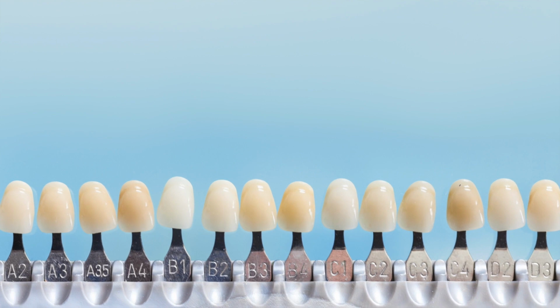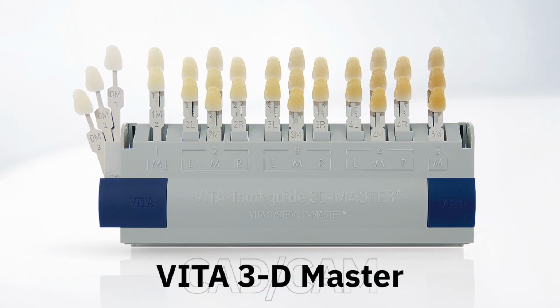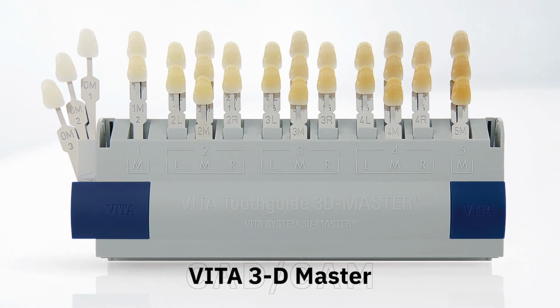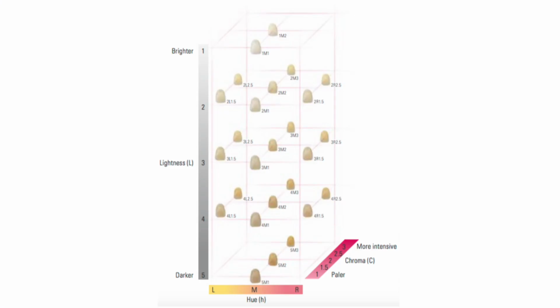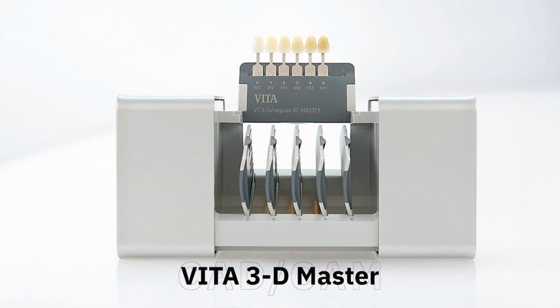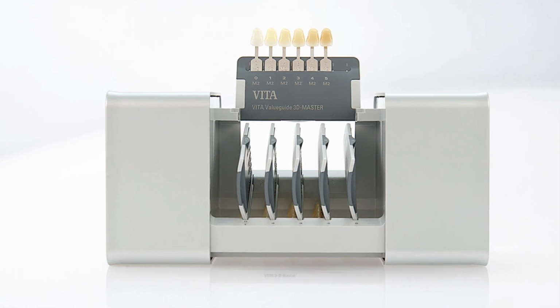And if you have something like a Vita 3D Master, now you're probably a little bit more advanced as far as what you can do and the spectrum that you can cover. But one thing to keep in mind there is sometimes dental labs don't always support the Vita 3D Master. If they don't have it in-house, then if you're using it and they don't have it, it's kind of pointless. You can't really communicate the shade as well if they don't use that.